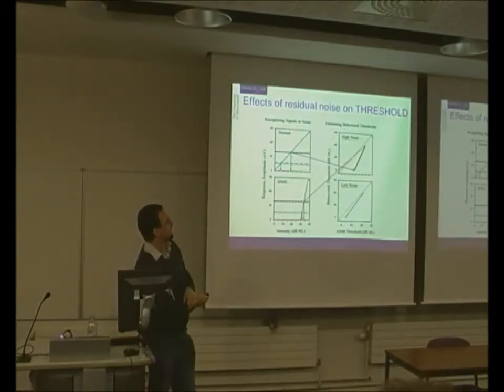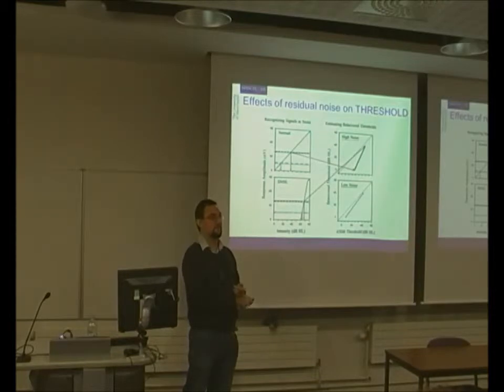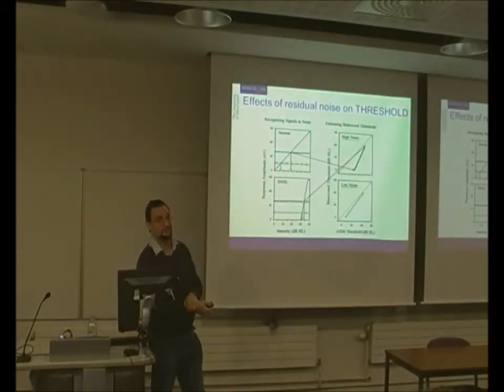But for a sensory neural hearing loss person, we get this rapid growth in amplitude close to threshold, so it's much closer to the true match line there, simply because of the rapid growth of amplitude. So we think that for sensory neural hearing loss patients, we can get closer to the threshold, but for people with normal hearing, we can't. And when we're doing threshold estimation, we want to, as I said, be able to find people who've got normal hearing just as much as we want to be able to find people who haven't got normal hearing.